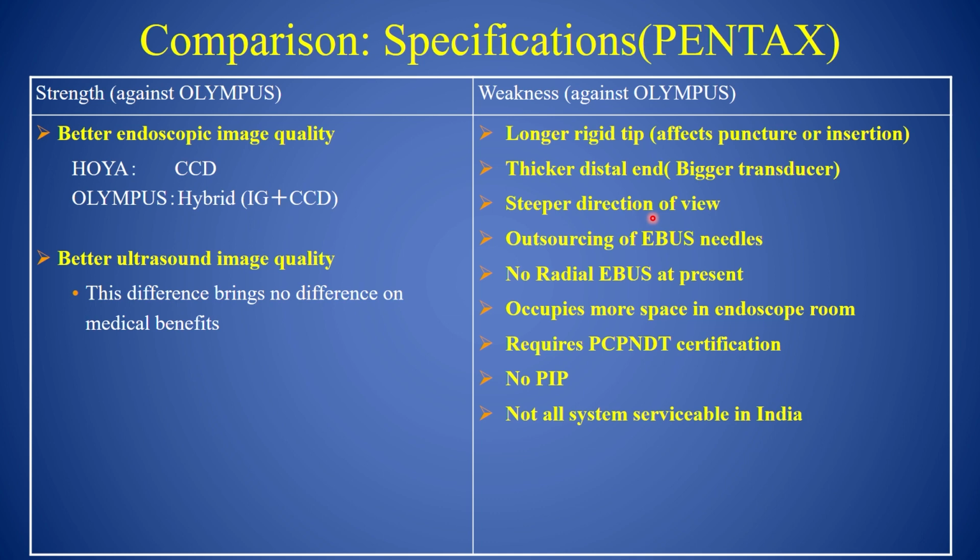It occupies much more space in your endoscopy room. The presence of a dedicated ultrasound system requires PCPNDT certification in most states in our country. There is no picture-in-picture available, and not all systems are serviceable in the country.